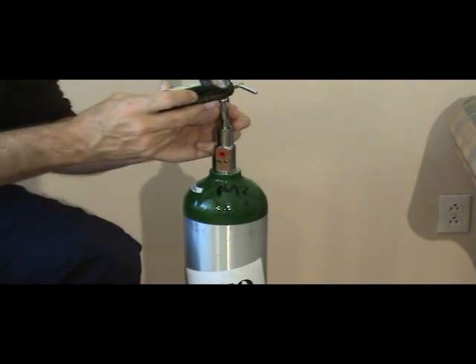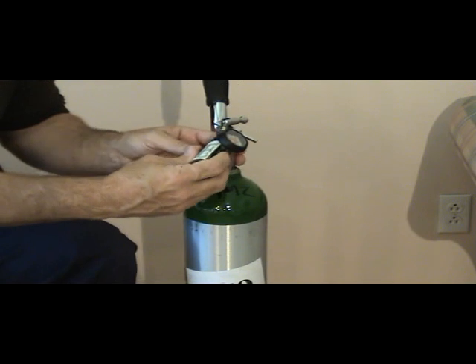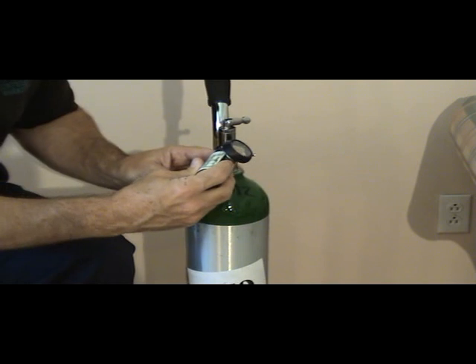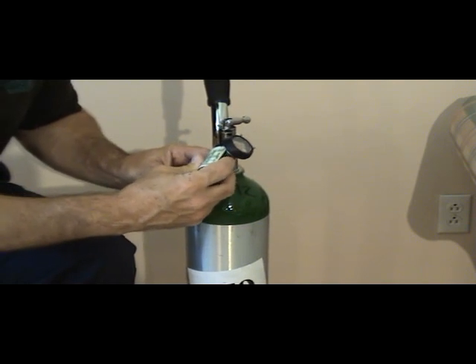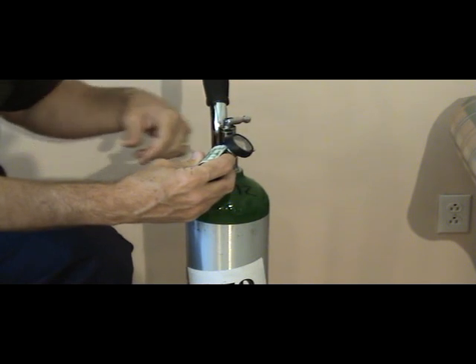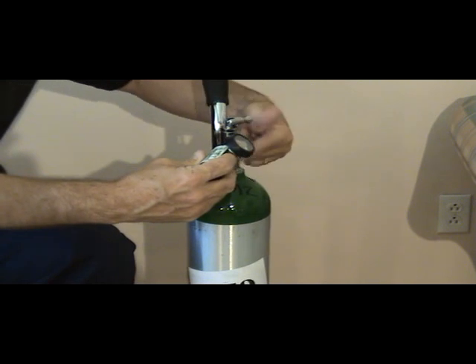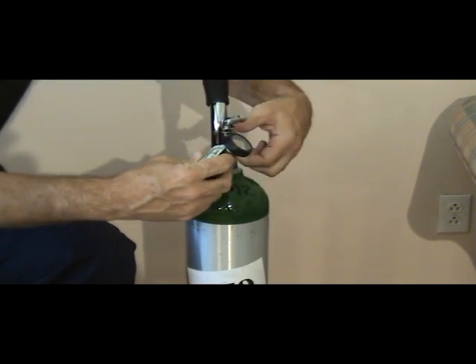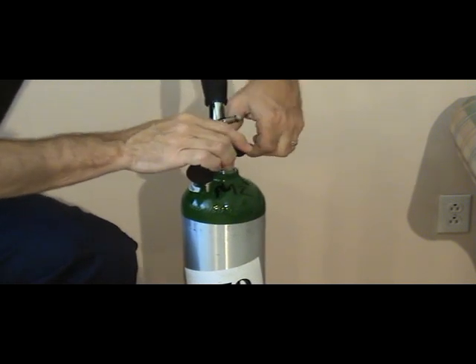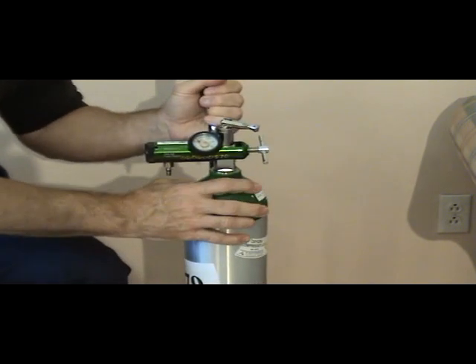You need to then put the regulator over the tank and position those pins into the holes at the bottom. You will feel them go in. When you feel them go in, then push it towards the bottle so that the pins are locked in. Then the T here on the other side, turn it until the screw goes into the bottle, and make sure that it's tight. Okay. Now we have the regulator on top of the bottle.